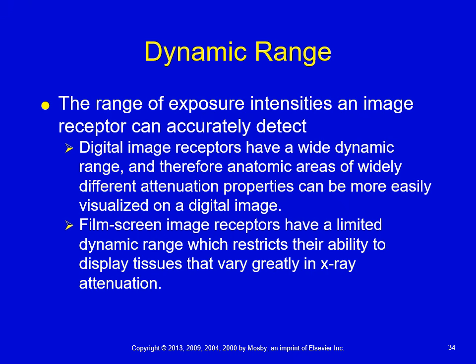All right, so again, wide dynamic range basically means there's more exposure levels that the image receptor can handle, and it can handle it and still give you a good image or diagnostic image. Jane's technique for the same thing is different from John's technique for the same procedure, but they both still get a good image. This is something that you'll see when you do get out to your clinical setting.